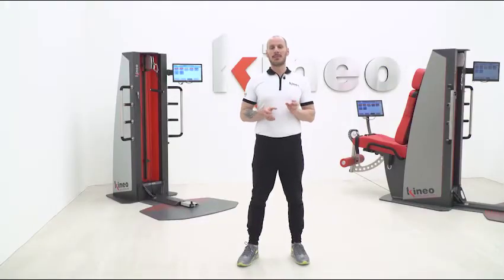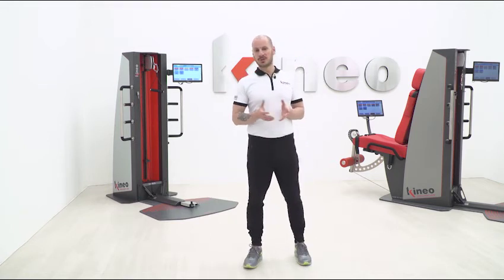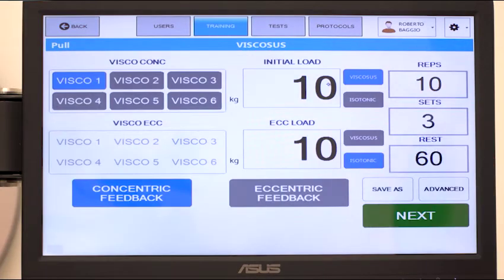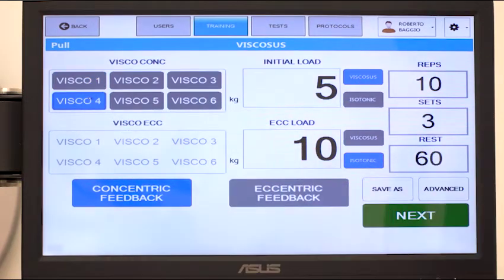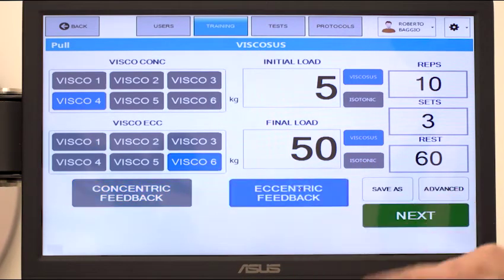The viscous mode can be used in both phases for a high intensity workout, which can find a possible application in hypertrophy training. For example, in biceps training we set a starting load of 5 kg with viscosity at 4 in the concentric phase, while in the eccentric phase we put 50 kg with viscosity at 6.